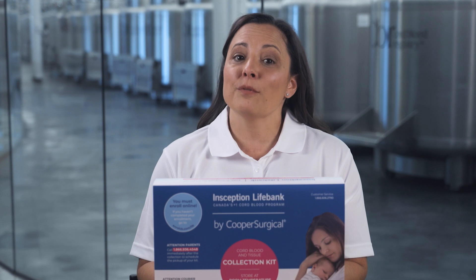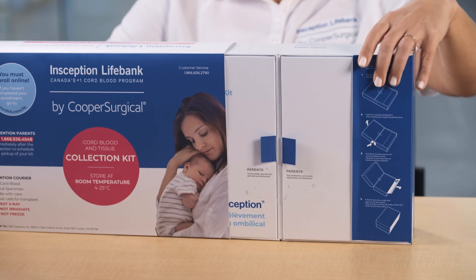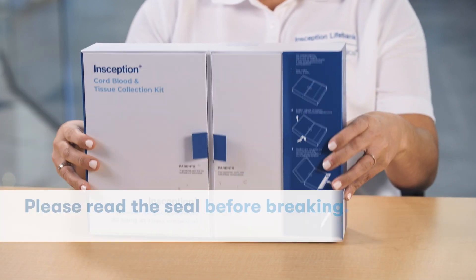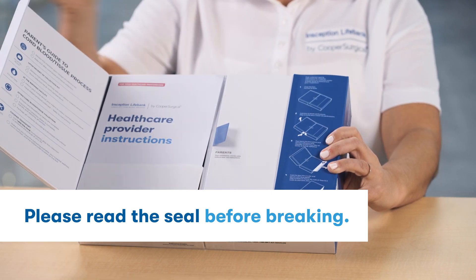It's important that you get familiar with everything inside. First, slide the sleeve off the kit. You'll see a seal and two doors. Feel free to break the seal between them to open your kit.